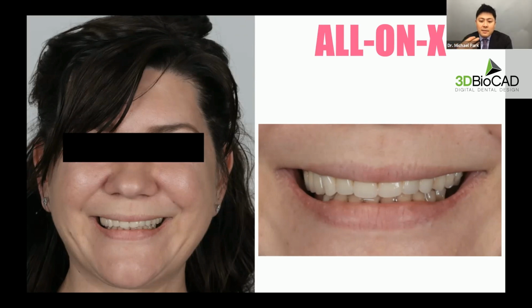In order for me to do that, traditionally what we did is we took a face bow to mount the upper cast, and then we mounted the lower cast using a bite record, and then we did our teeth setup, right? You can do it using a traditional wax up, or we can do it in a denture fabrication process where we use denture teeth to set the teeth. But in this case, I wanted to do this case completely digital. So I'll just go over the digital workflow.